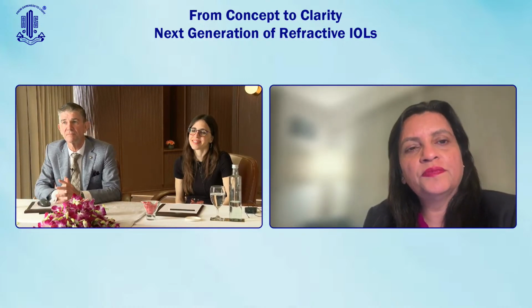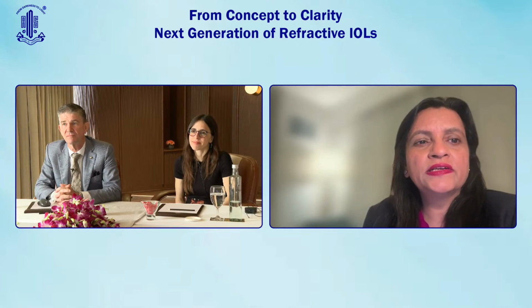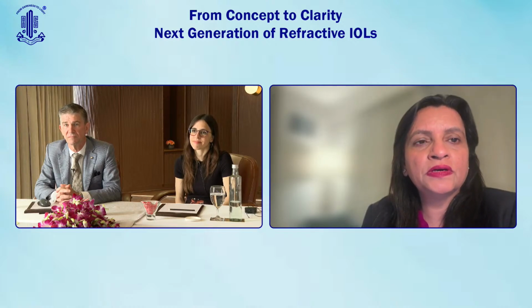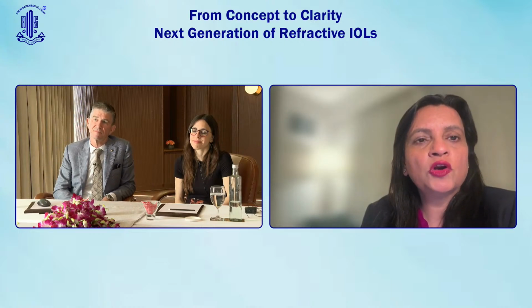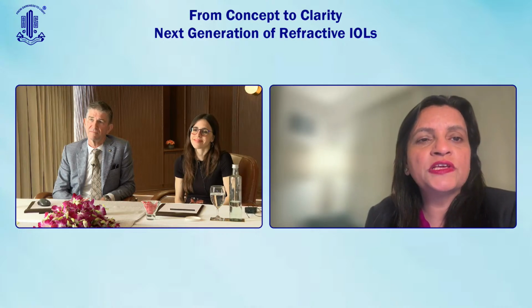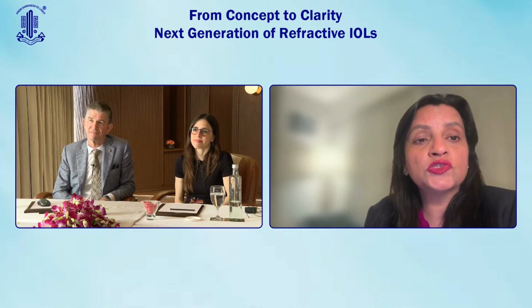It is very heartening to know that generally, multifocals you would avoid in cases of refractive surgery like PRK, but you very clearly illustrated that it does make a difference because the contrast gets better. Likewise, even when there is an epiretinal membrane, most people may not want to do the multifocals or the EDOFs, but the real patient experience, saying that it's kind of become clear except for the part which is distorted, reassures you that you can do these lenses even in such patients.